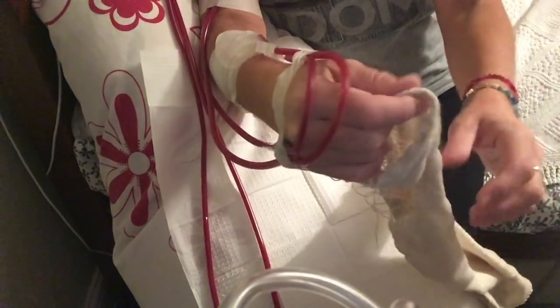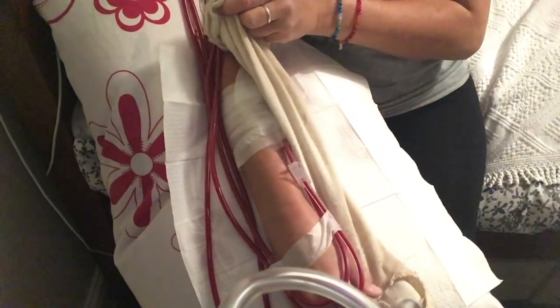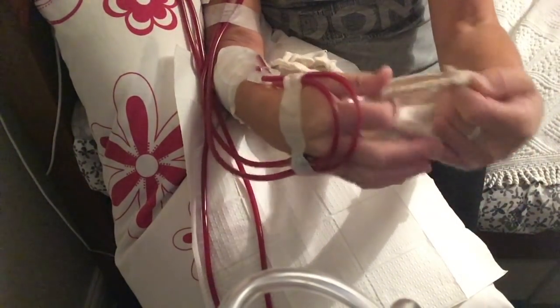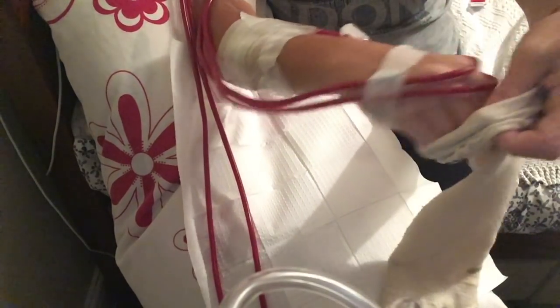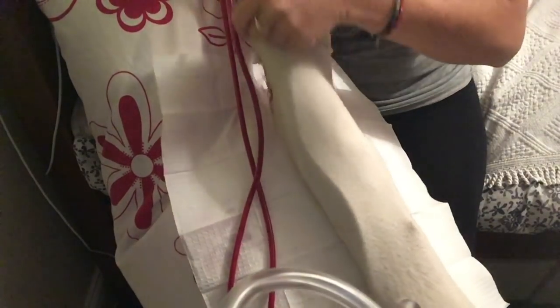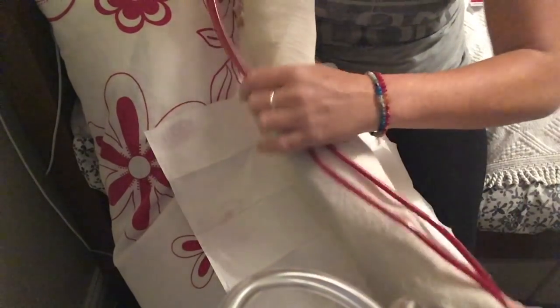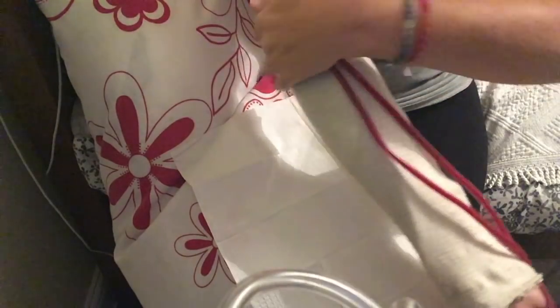The final thing I do — because I'm sleeping — is I've made my own Chibi Grip bandage, which just covers my whole arm and the lines. It's got a hole in it for my thumb over my hand. It's something I just made for myself as an extra precaution. I slide that up and over, so it keeps everything neat and tidy and tucked in. Then I tape the lines to the top of the bandage as well.